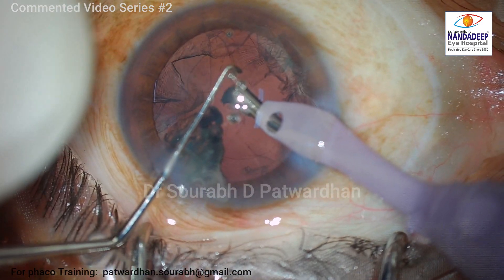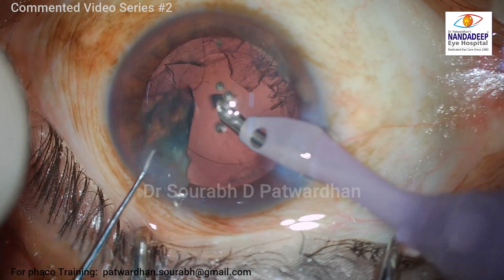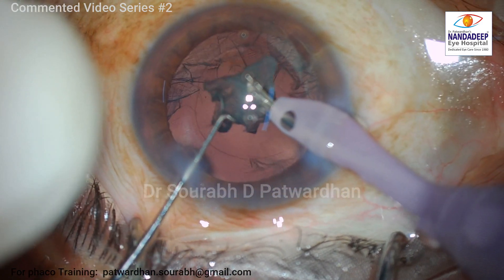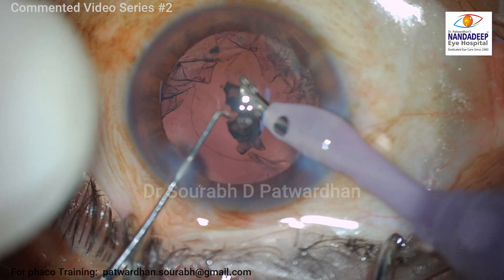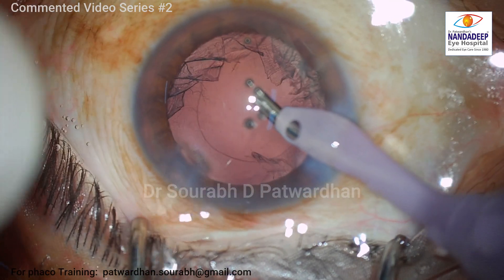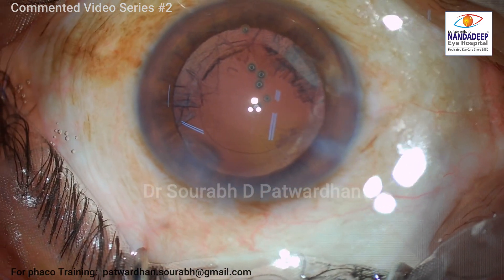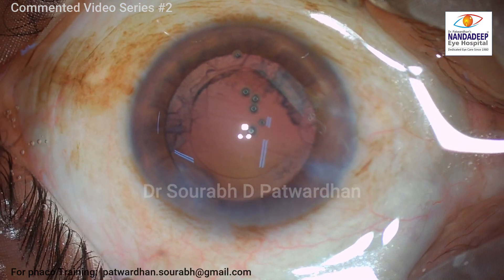I am watching carefully for any posterior capsular fluctuations. So far I didn't see any movement of the posterior capsule, so I continued doing phaco here. If there was even a little bit of fluctuation I would have reduced the vacuum more, but this was okay, so I could finish off the case without much issue.